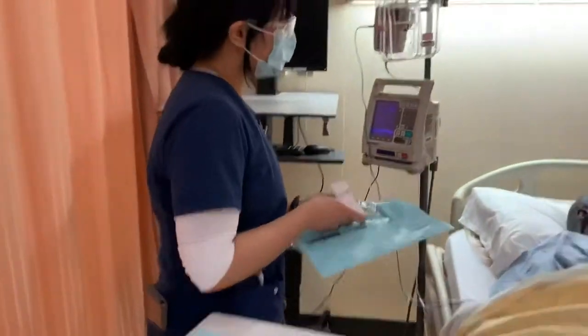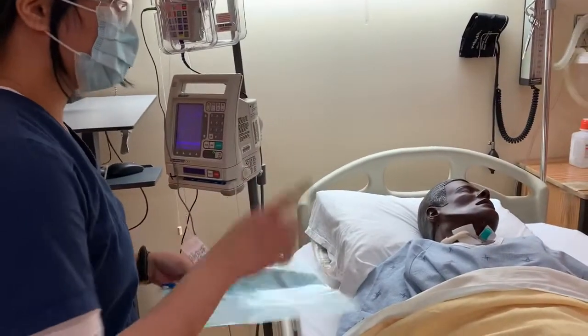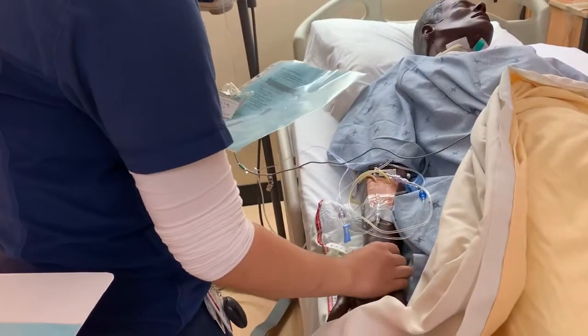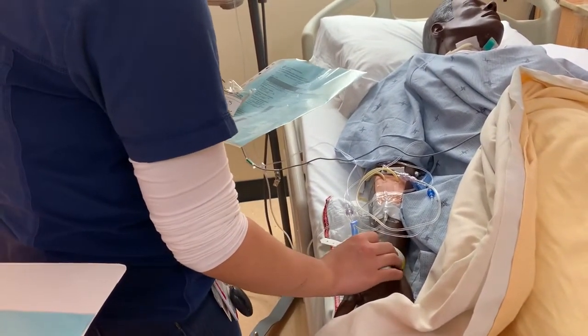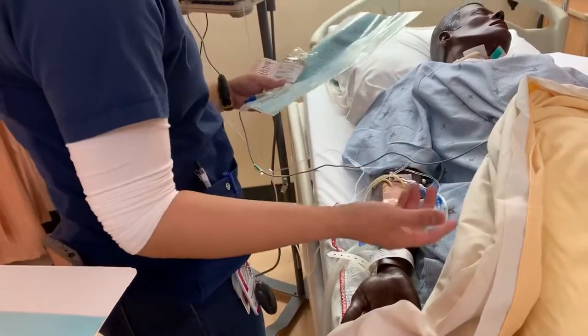So hello, my name is Rika and I'm your nurse today. I'll be giving you morphine. This is your pain medication. Before I do that, I'm just gonna check your wristband right here. Can you give me your full name? Okay, Marcy Paris. Can you give me, how old are you? 55 years old, that's what we have here. You don't have any allergies. The patient doesn't have any allergies, so we're good.